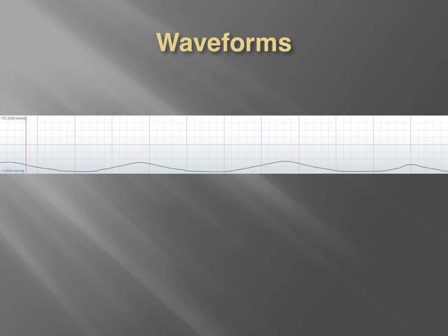Here's a patient that we had where we got called to a nursing home for an unconscious patient, and the nurse said, well, she was fine all morning, and all of a sudden she was just unresponsive. And so we hooked up a cannula while we were doing our initial assessment of vital signs, blood pressure, pulse ox. Even though pulse ox isn't a standard vital sign, we always do it right away, and blood pressure and all that. And we have an adequate respiratory rate because we're looking at it here versus just eyeballing it. And this is the waveform that was presenting for us.